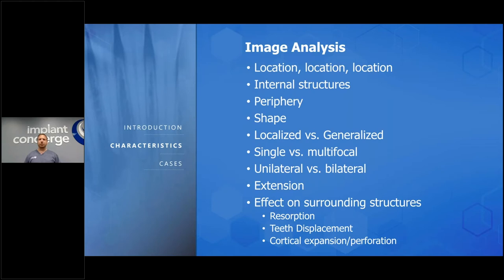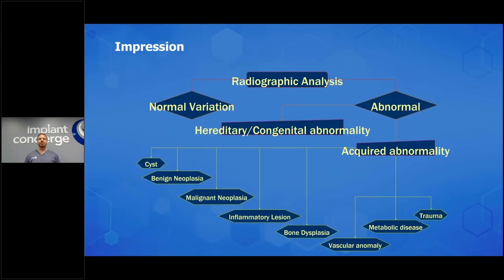I really recommend that for maybe the next 10 patients that have unusual findings, you print this page out, have it next to you, and refer to it for the first 10 patients, because after that, it'll just become automatic. So this is a really nice workflow. I really like this. It really shows how you get to the impression.